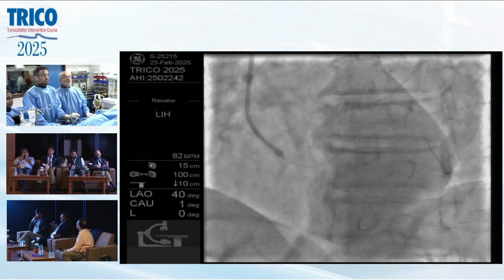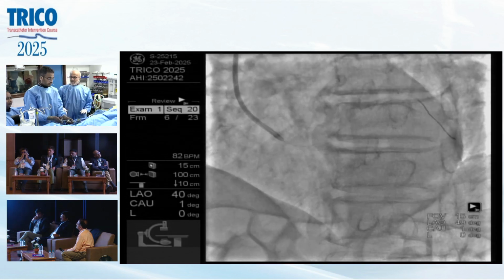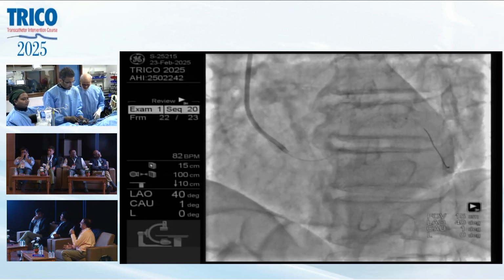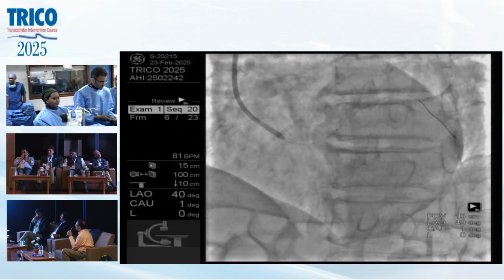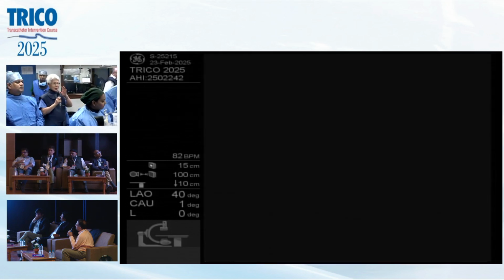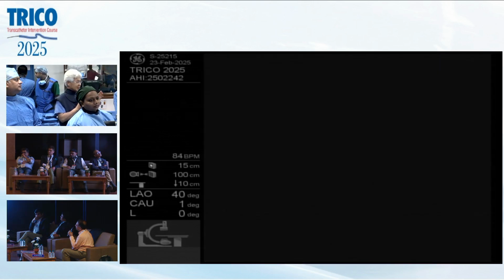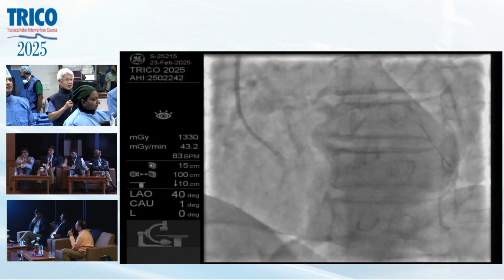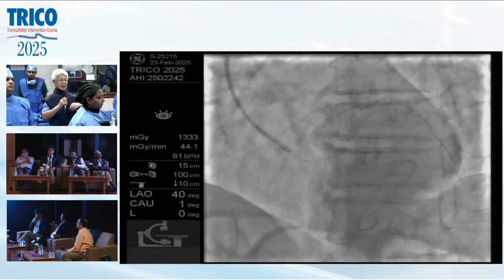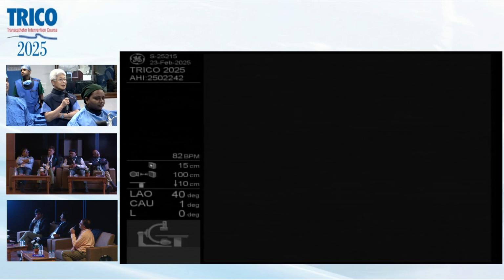Okay. Go up here. So I posed the question to Dr. Akasaka, and he has the answer for you. The question is, is there any significant difference between the anomalous right coronary artery and other coronary arteries, the normal versus anomalous? Is there any histologic difference? In my knowledge, there is no significant difference, I think. Okay, that's good to know.